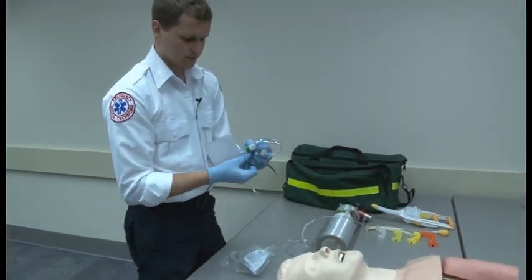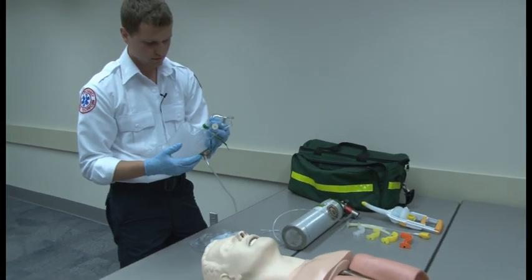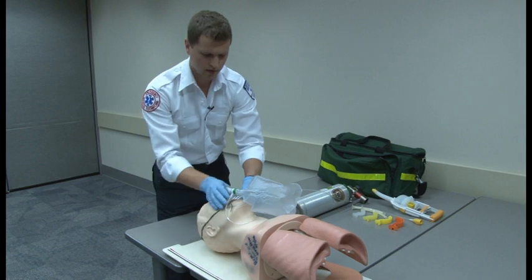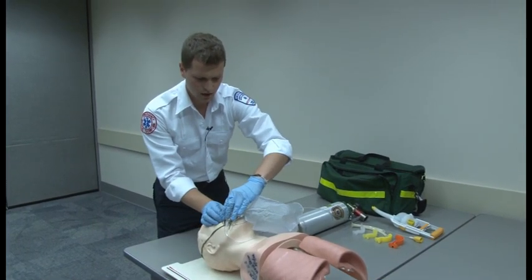Now I'm going to pre-fill the bag. I'm going to put the oxygen over the patient's face. I'm going to tighten it so that it's snug and surfaced. And I'm done.